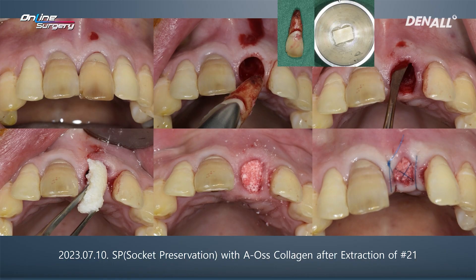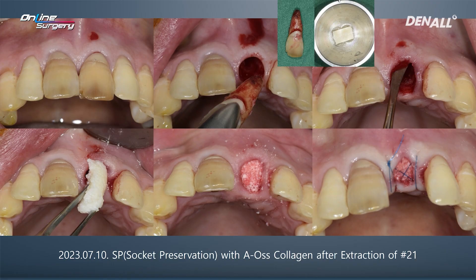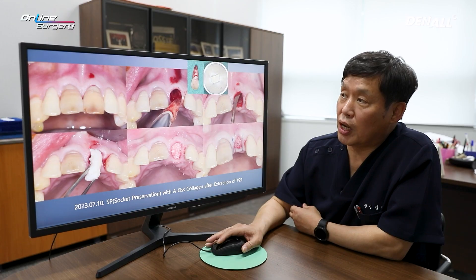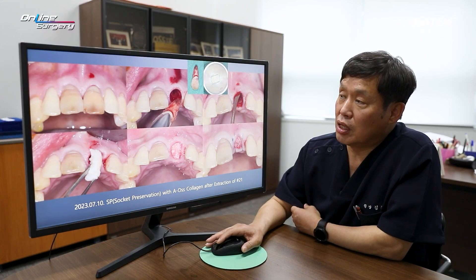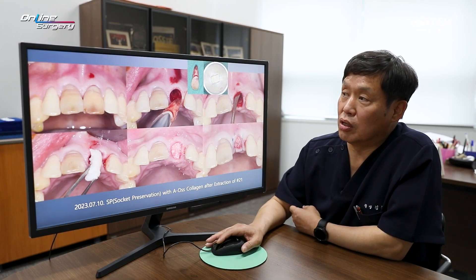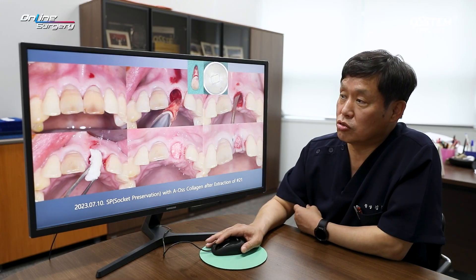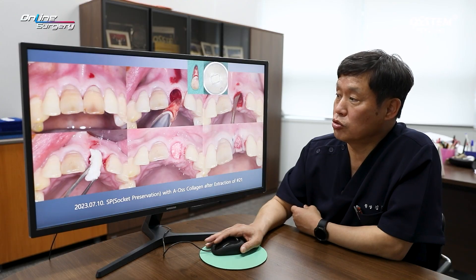Looking at the upper right image, you can see that the labial wall is completely destroyed. To address this, we performed thorough socket preservation using AOS collagen. A hidden X suture was used. Although gingival height is not an immediate concern, the extensive loss of labial bone means that in future implant placement, the soft tissue on the labial side may shrink significantly. Therefore, we planned a two-stage surgery, beginning with socket preservation.